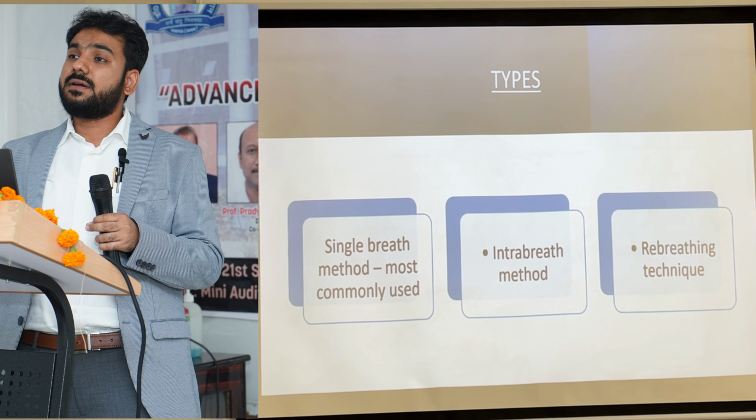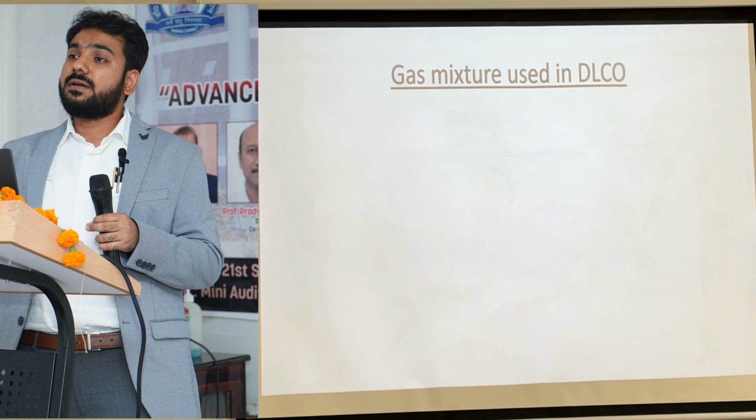Another method is the intra breath technique, in which we don't have to do a breath hold. During a portion of the breath, a small amount is collected. It's not very standardized, but what we are going to see most commonly in our daily practice is the single breath method, which is most commonly used, and in the majority of places it is the single breath method that is available.